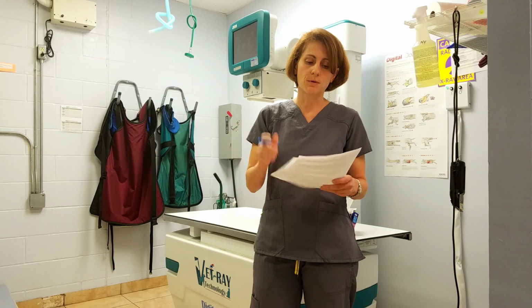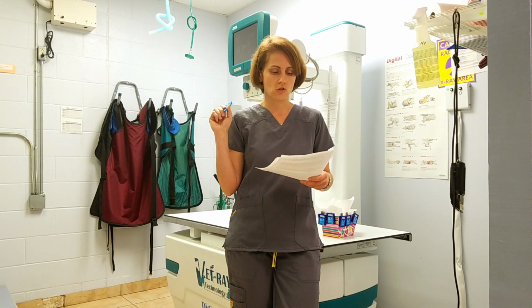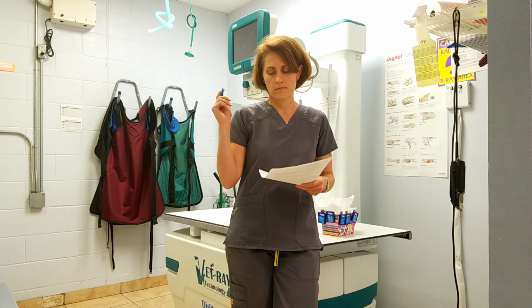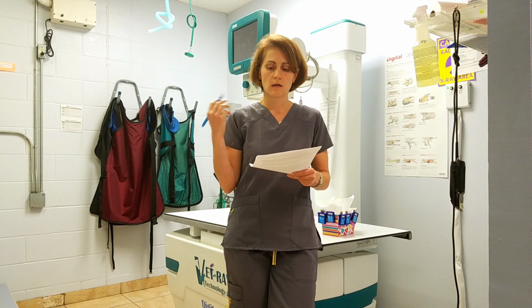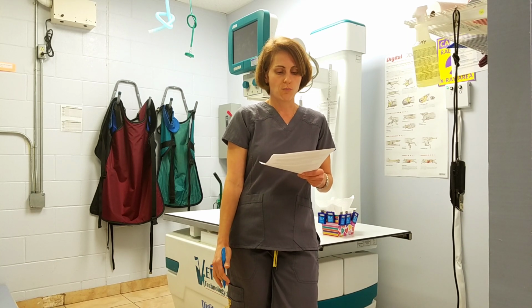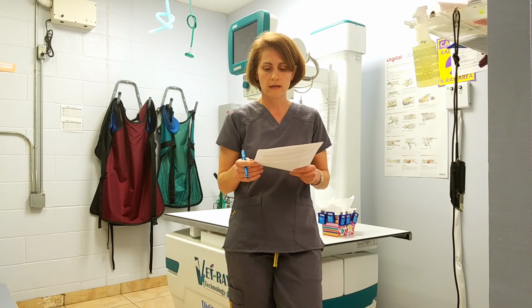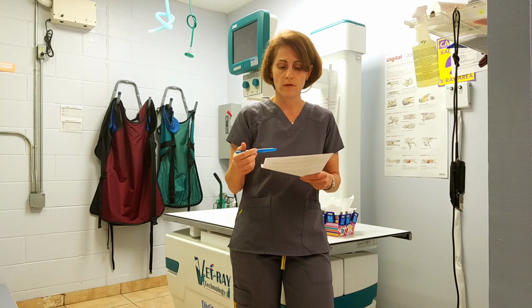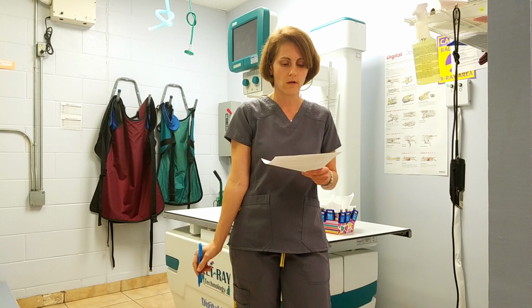But the protective devices are stored in the x-ray suite. We will show you those in just a second at the end. We check these aprons and shields annually, so once a year we check them for holes, cracks, any type of defect that would make them less safe. Certainly if at any point you feel like there's a problem with one, if it gets dropped, if it feels crunchy, if it feels weird to you, please let us know so that we can stay on top of that. A record of the checks that we do on those are also kept in the state radiology binder, so if you ever want to take a look at that, that's available.